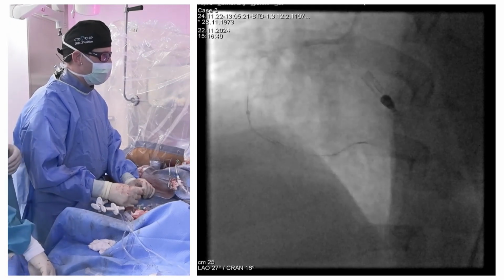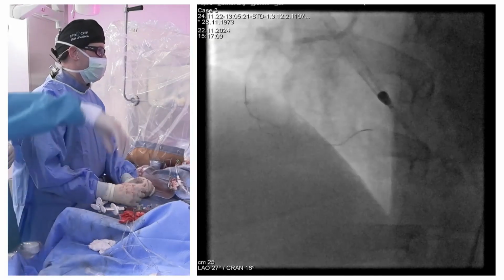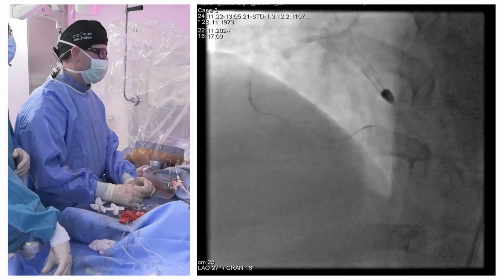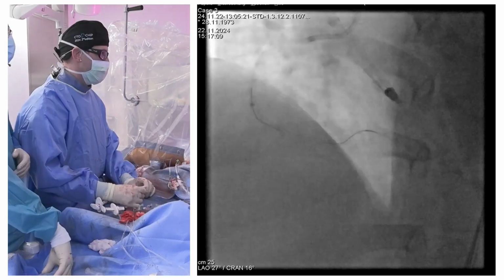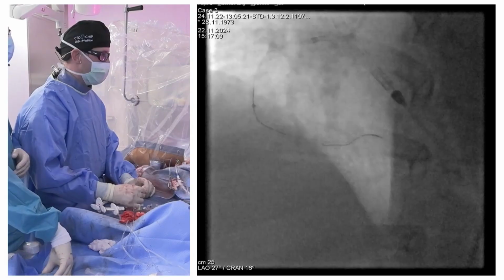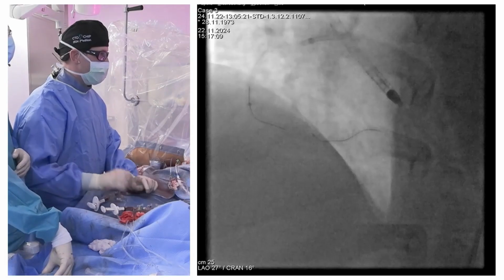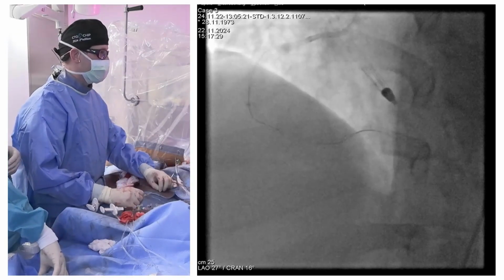I mean, if you are lucky and you just enter with the Gladius centrally, a stent, CTO, then you're lucky. But if there are some reasons for the stent failure in between, it can be, of course, troublesome. And again, the Caravel here retrogradely is not working well through the stent struts. And yeah, this is where we are right now.